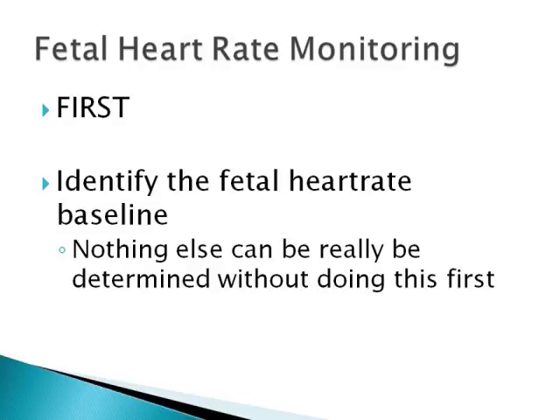Alright, fetal heart rate monitoring. First, you have to identify the baseline. You can't tell anything else if you haven't measured and identified the baseline first, and quite often that's recorded in terms of a range, like 120 to 130 for instance.